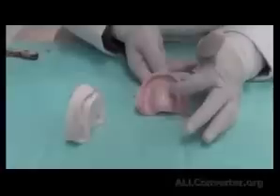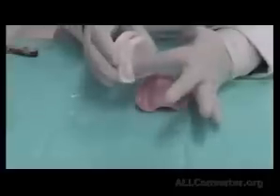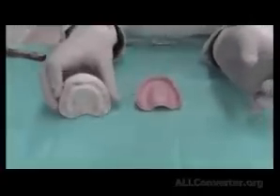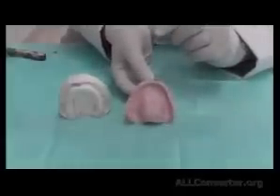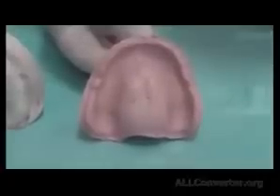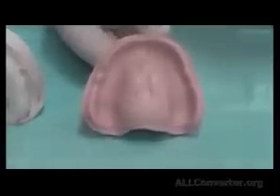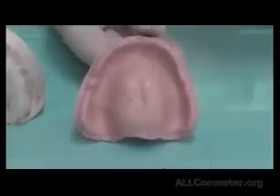So the cases where we have what we call a high vault, patients that have a very deep palate, might also have a big bubble here. We could add impression material inside the patient's mouth on the palate before loading the tray. So that's done with people with a very high vault palate. So we make sure that our impression is perfect, and this is ready to be disinfected and sent to the lab. Zinc oxide eugenol is a material that is stable. It could withstand soaking in disinfectant materials, and we disinfect it in a medium strength disinfectant, and we could soak it there.